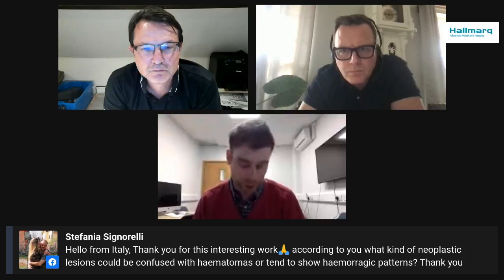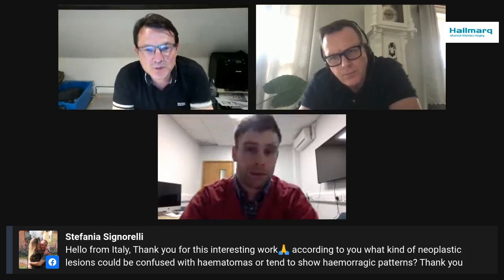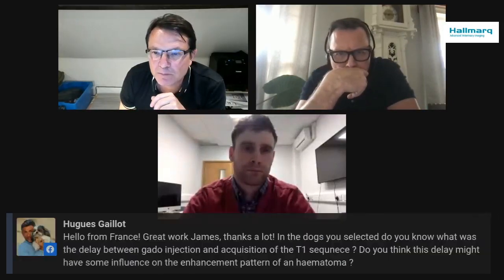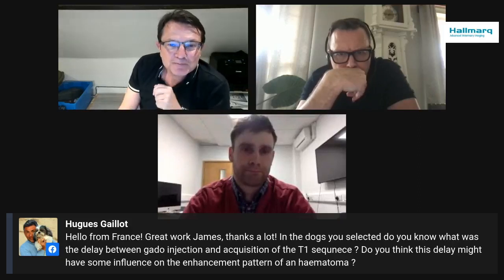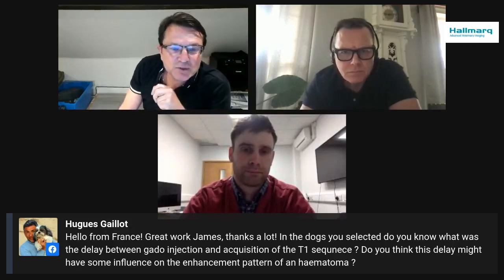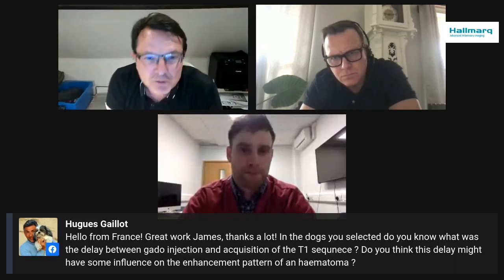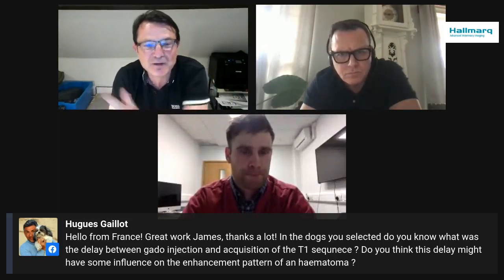But you obviously have far more experience, and probably in your day-to-day work you see far more brain MRIs than I do. I think the contrast enhancement can also differ; for example, ring enhancing glioma tend to get more delayed, more central contrast enhancement, and that goes a bit with one of the questions, I think from France now. In the dogs you selected, do you know what the delay was between the gadolinium injection and acquisition of the T1 sequence? I think you are making allusion to glioma that tend to have delayed central contrast enhancement.